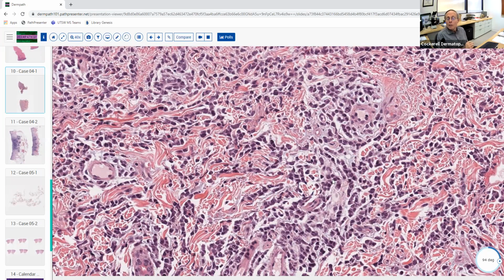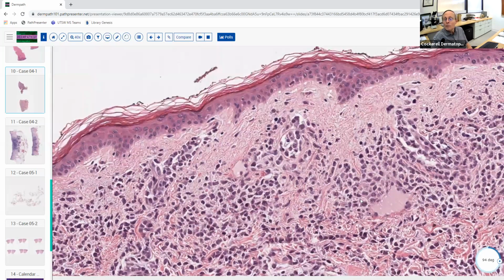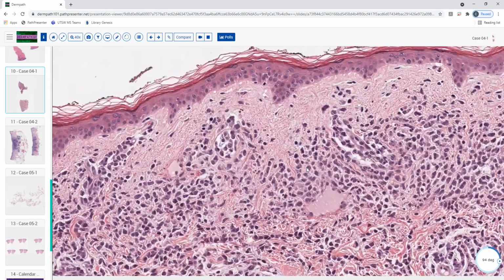Okay, so you've been taught that when you see an interstitial pattern with cells in cords and strands, that should make you think of some type of metastatic process going to the skin, one of which is metastatic carcinoma. Which is the most common metastatic carcinoma? I guess ductal. Well, metastatic breast cancer. Yes, that's right. That's by far the most common one to do that. Not the only one. We see it in prostate sometimes, and in other things. And then we see it in this entity. Is this metastatic breast cancer?